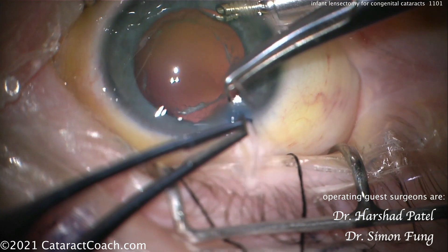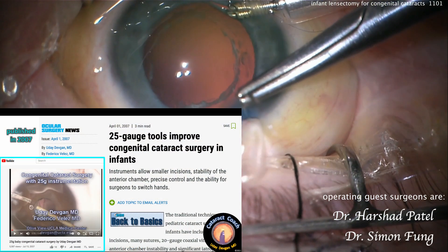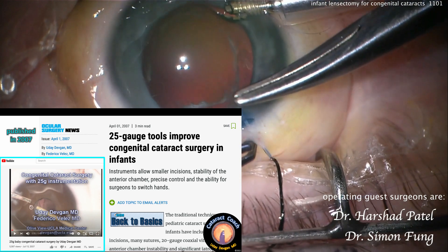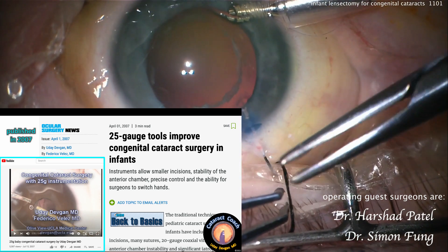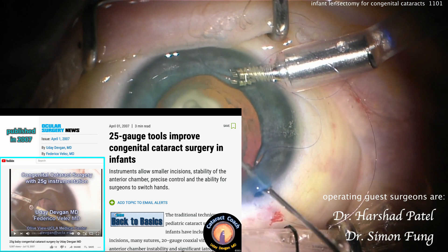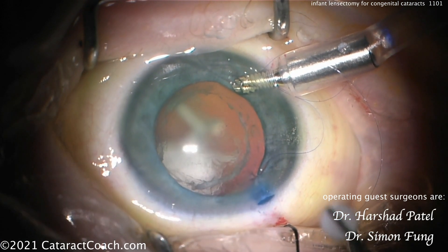I've had an interest in this for a long time. Back 14 years ago in 2007, I worked with a doctor named Federico Velez, another pediatric ophthalmologist, and we described 25-gauge retina instruments to do congenital cataract surgery in infants. We made even smaller incisions because we did 25-gauge instead of 23, and we did a bimanual approach instead of an anterior chamber maintainer.